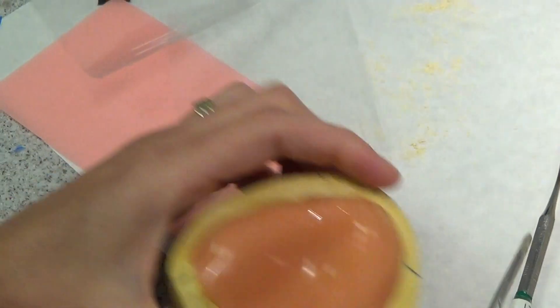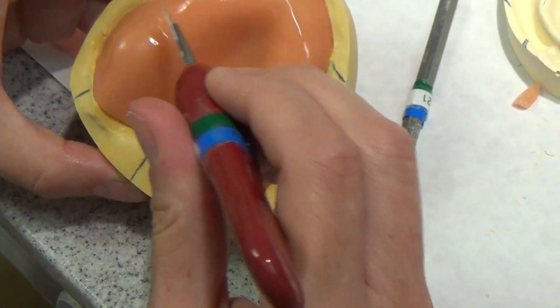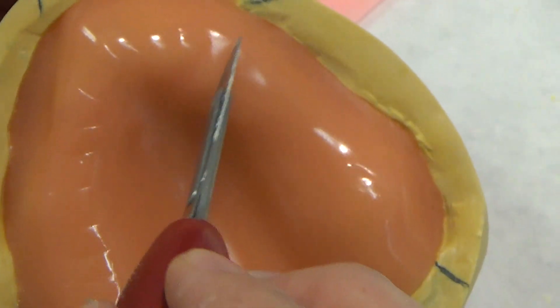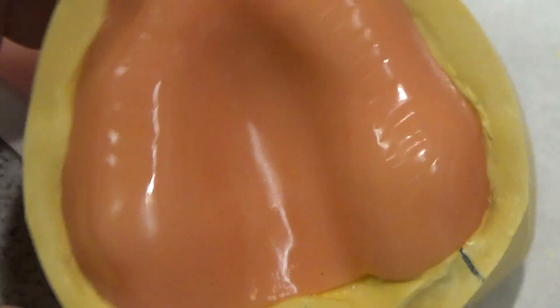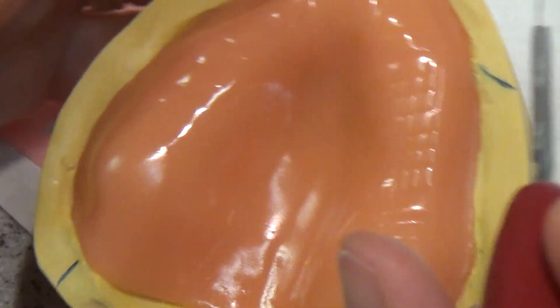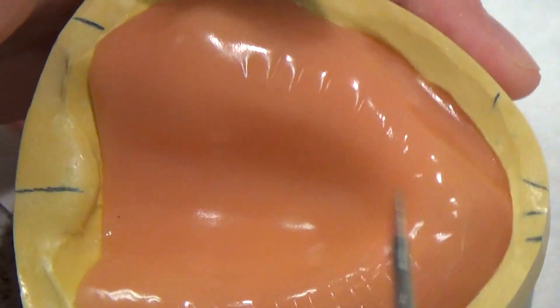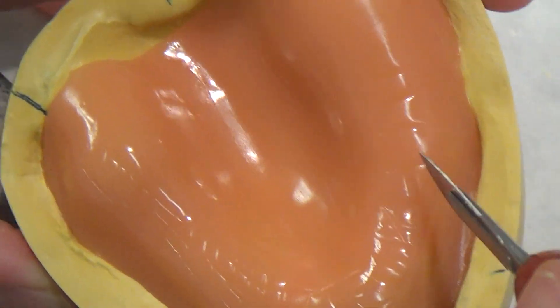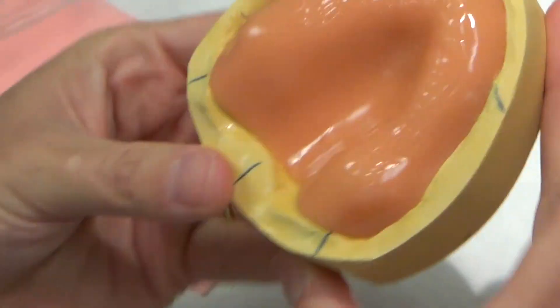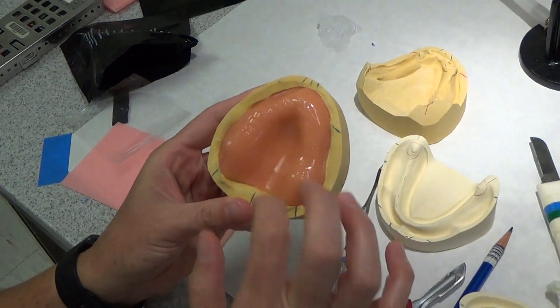Now the last thing I want to do before I cure it is put my grooves in it. I take my 20 blade and go along, slightly buckled to the crest of the ridge in one direction, then come back and do it again. I'm not piercing all the way through — I'm just scoring the top part, not putting a lot of pressure, just enough to put little grooves. And now I'm going to cure this.